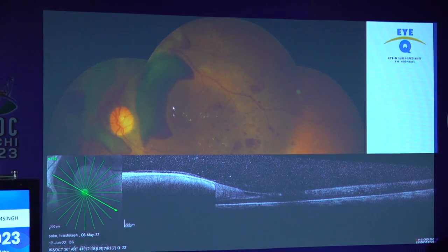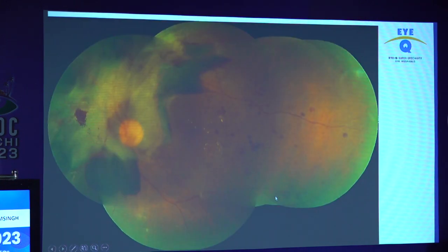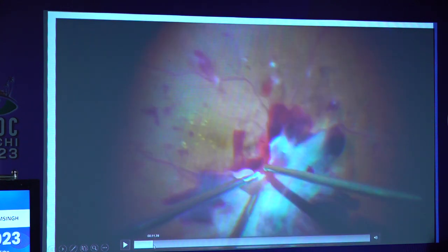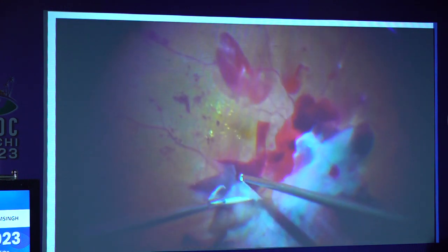And you might wonder why we were doing surgery for this, but you can see this traction distorting the fovea, and after anti-VEGF, you can again see this getting worse. So these are rather tougher cases, where maximum retina is attached and you have a very limited tractional detachment. So as you will see here, this is typically the answer to that question.